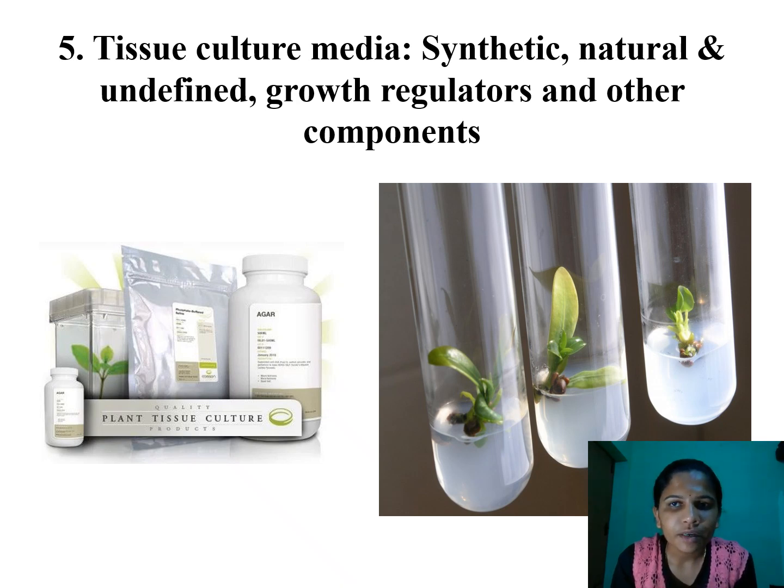One is ready-made media and another one is natural, like the conventional method. We have to prepare growth regulators, macronutrients, micronutrients, and also the gelling agent separately. Everything we should add separately. And the ready-made mixture is the one which can be directly used. They will always recommend like 34.7 grams in 1 liter of water.